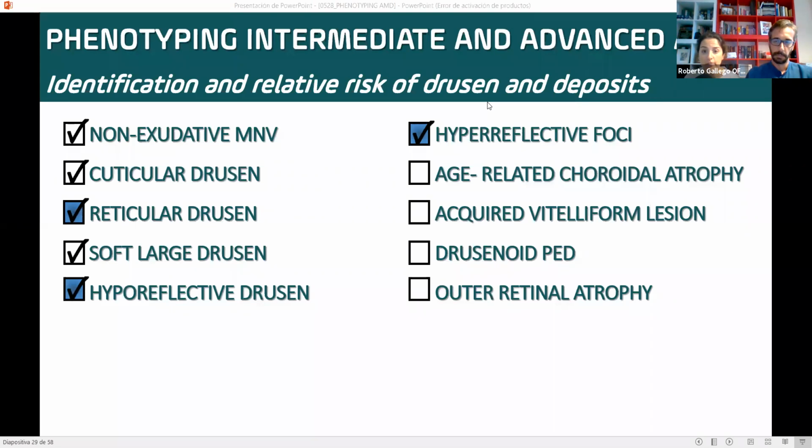If you see hyperreflective foci and in the fundus you can correlate with hyperpigmentation, then you know it's pigment derived. And if it's correlated with some yellowish appearance in the fundus and it's a vascular component, or maybe a type 3, it's more like lipid. But for the microglia, I don't think we have a real marker. So it's impossible to say really, just by the structural OCT appearance, what they are exactly? Yeah. Okay.